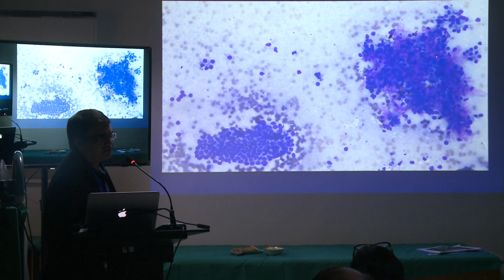Not to me, I don't. Okay. And they are not running away from each other either. And you see a lot of fibrous tissue on that. So I'm not sure how she developed it. Bottom line, it was a chronic pancreatitis, but it's a focal area of chronic pancreatitis. And I don't know if she had a stricture there. How did that happen? Rest of the pancreas looked fine.